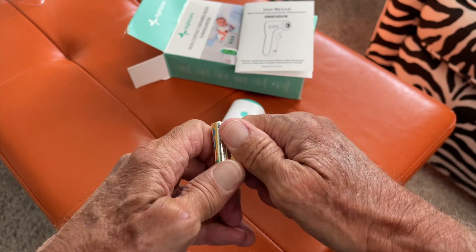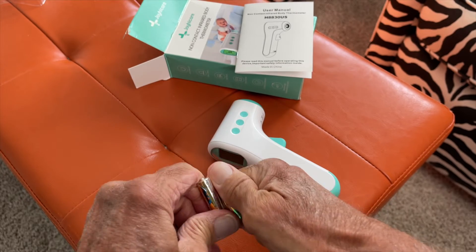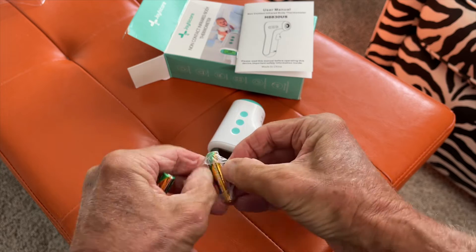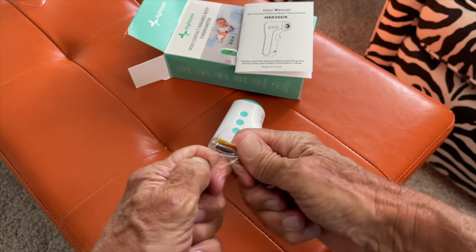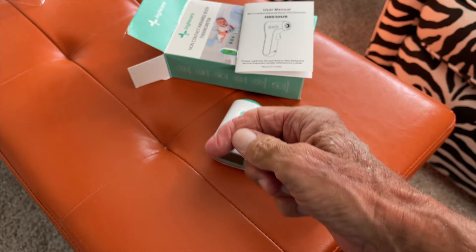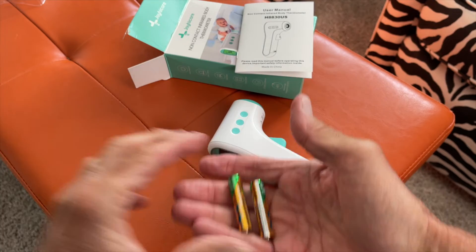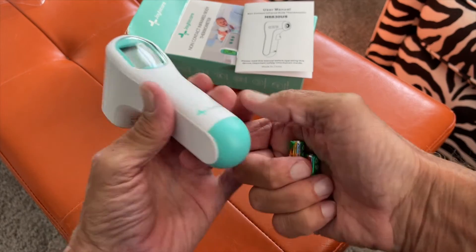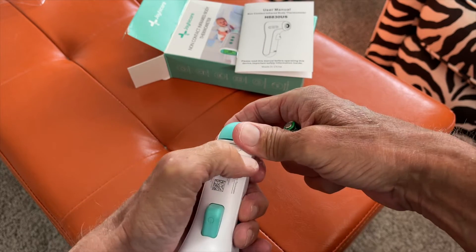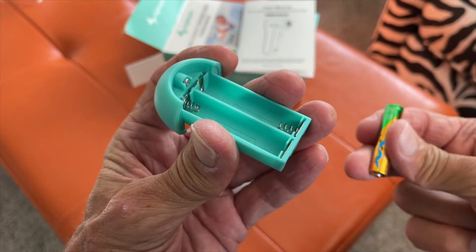Let's go ahead and open this up. I'm going to do a little twist on it to get them free. Getting stuff out of the package is the hardest part of everything. We've got our two batteries, and I'm assuming this works kind of like the other one — you push this and it pops open. Pretty simple.